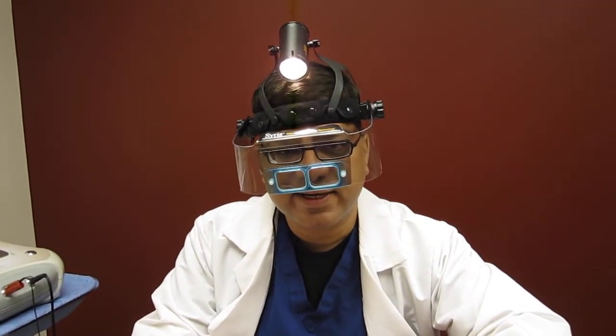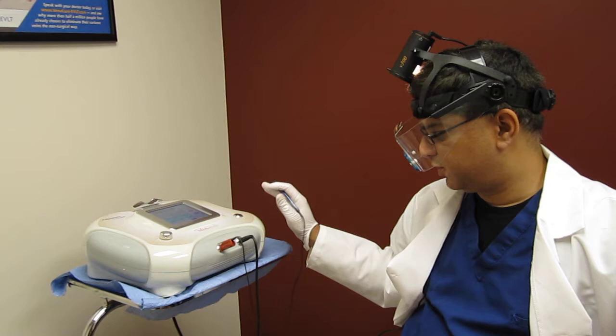We're going to start the treatment for the VaneGo Thermolysis system for treatment of spider veins. We're going to be treating the leg spider veins today using the VaneGo system, which is this machine right here.